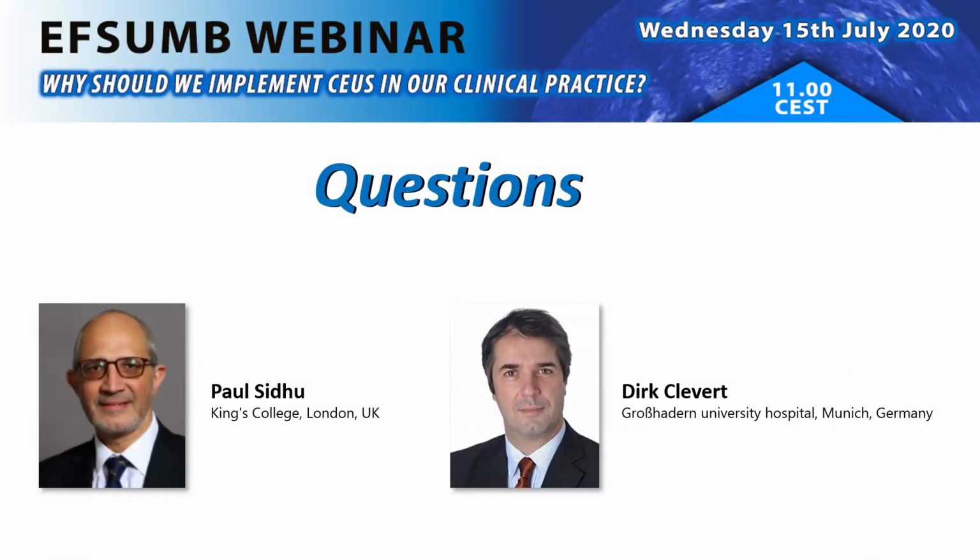Okay, I think you can hear me. Yes. Thank you very much, Dirk, for that very clear overview of the vascular uses of contrast-enhanced ultrasound. It's very important that the audience also realizes that the imaging you were showing is very wonderful, with really good resolution, and you're showing images of veins down to 1, 2, maybe 3 millimeters. And this shows the use of contrast as a problem-solving tool. You pick the one area, you put your probe on, and you have a diagnosis of a 2 millimeter area immediately.